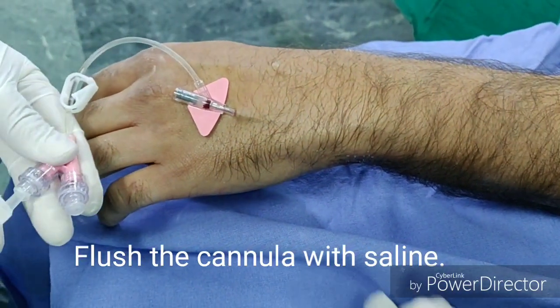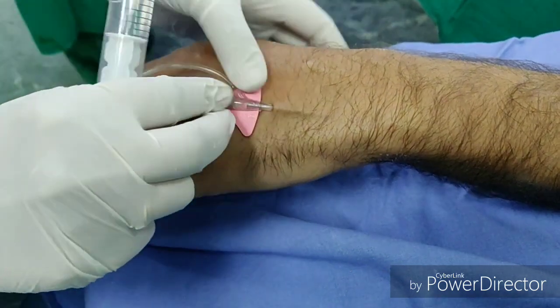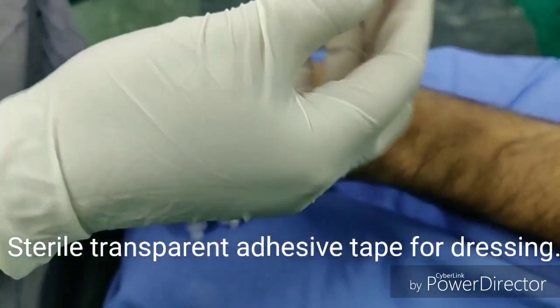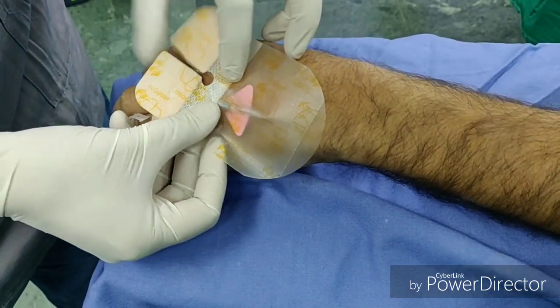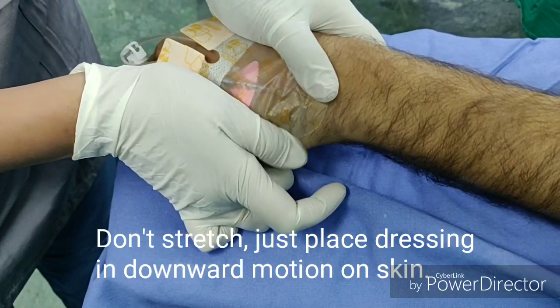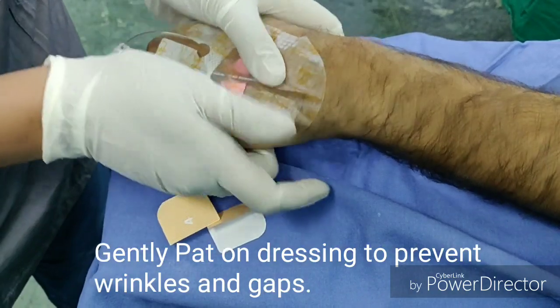A wound is created on the skin by IV insertion, through which microorganisms from the skin may enter the bloodstream. Hence, choose a sterile transparent adhesive tape for dressing that fits the anatomical location. Dry the skin before applying the dressing. Do not stretch the dressing as you apply it — just place it gently in a downward motion onto the skin without any tension, and gently pat on the dressing so there are no wrinkles or gaps.